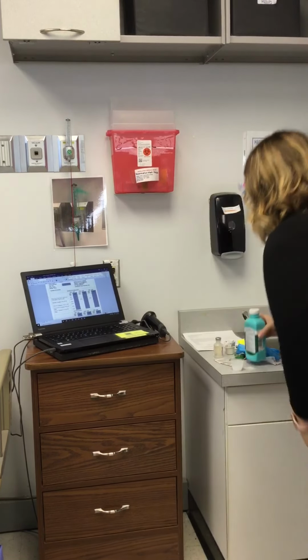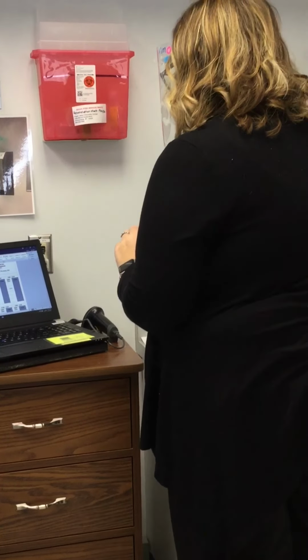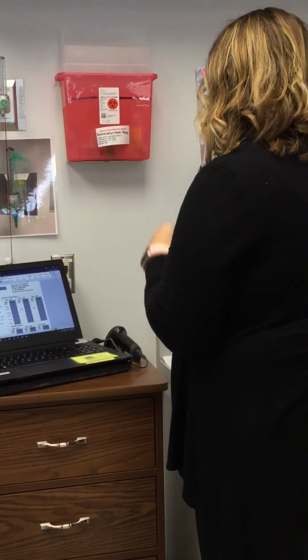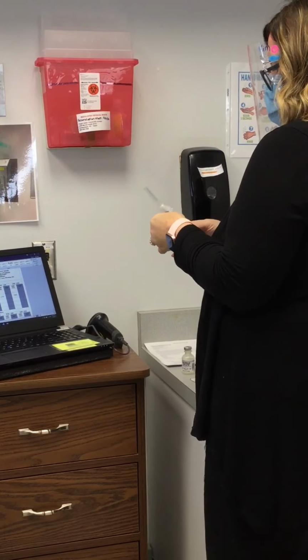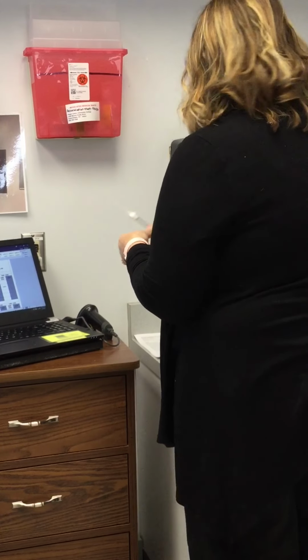Next I have the ketorolac, which is 15 milligrams per ml. My order says I need 30. It is due at 0600. It's going to be given via IM injection, which is why I picked the needle size that I did, which is a 22 gauge 1.5 needle size. And because I only have 15 milligrams per ml, I have 2 mLs in here to equal my 30 for my order, and my syringe is labeled.